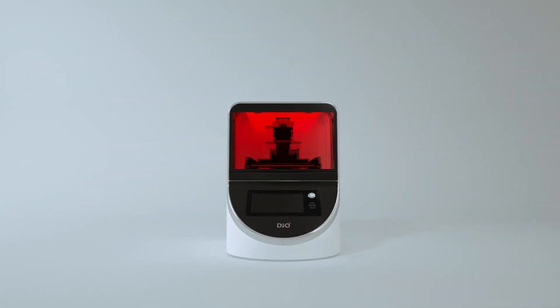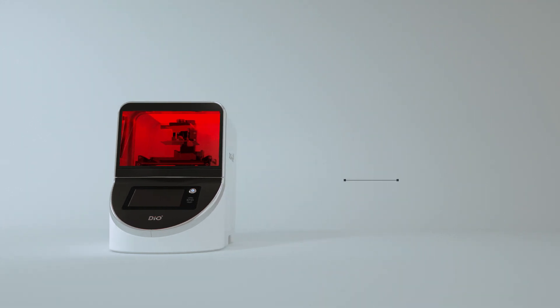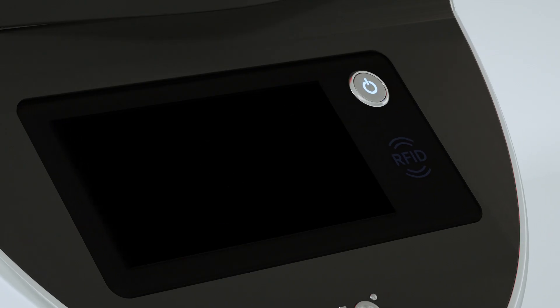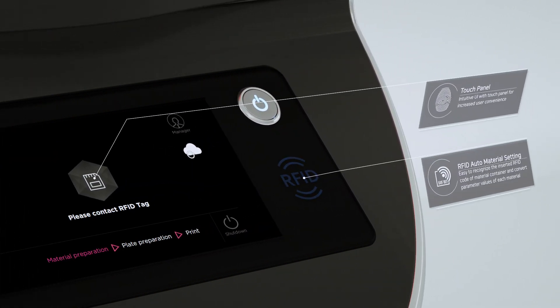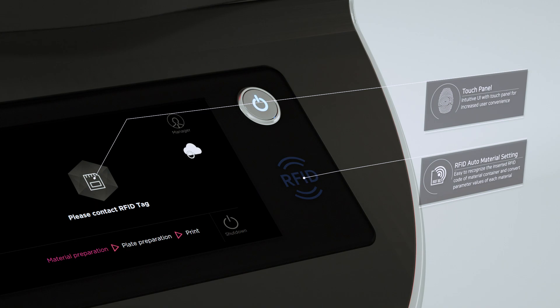Maximizing the clinic operational excellence. Dio Provo is easy and instinctive. The front touch panel will let you control and see the whole process.